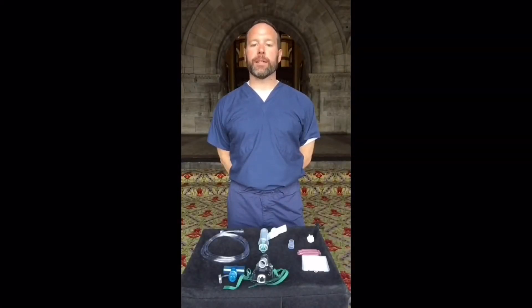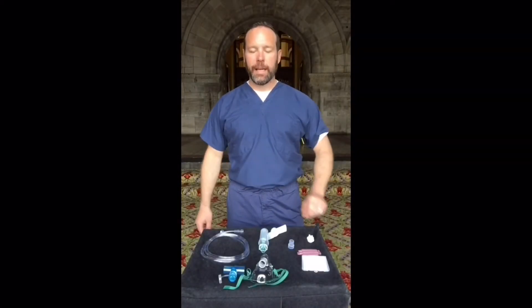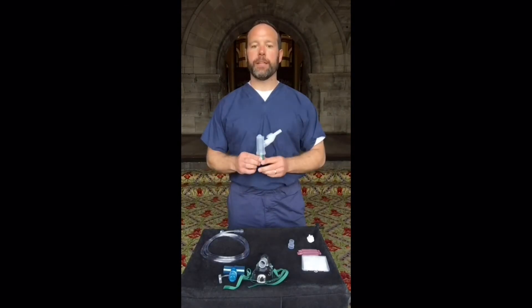I'm Josh Vandervelden, Clinical Product Specialist with Salter Labs, and I'm here to go through the in-service for the Nebutek nebulizer.